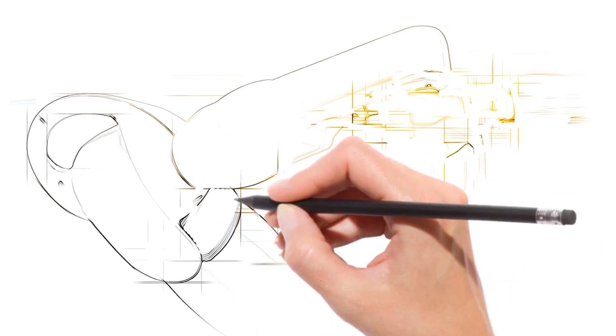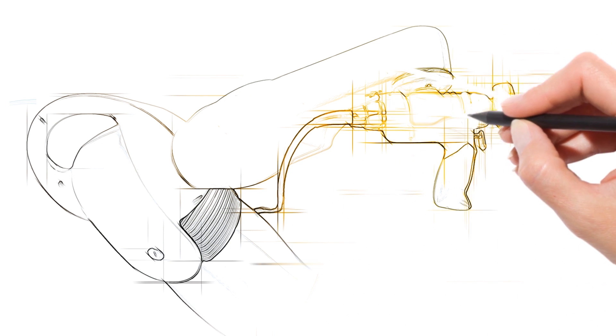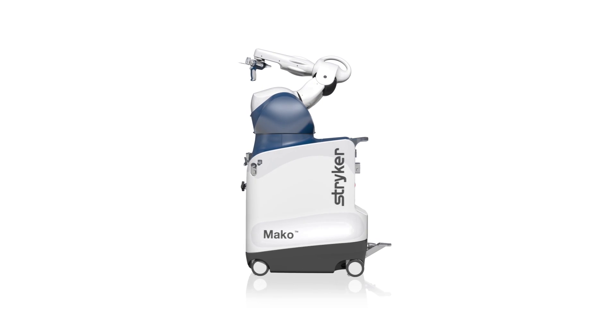The changing healthcare environment is creating uncertainty for many. MAKO robotic arm assisted surgery enables you to have a more predictable surgical experience and offers you a leadership advantage in our evolving healthcare environment. Let's create the future together with MAKO Total Knee.